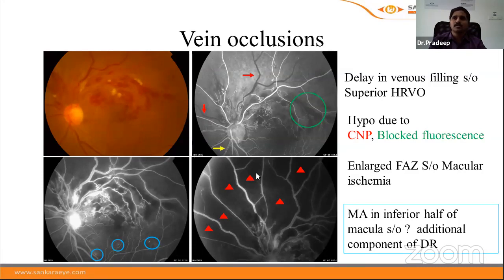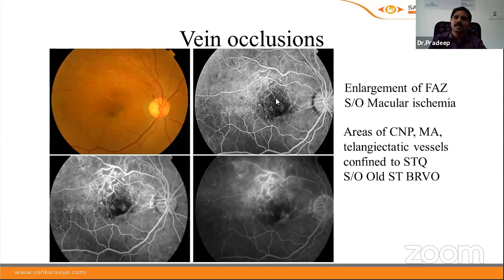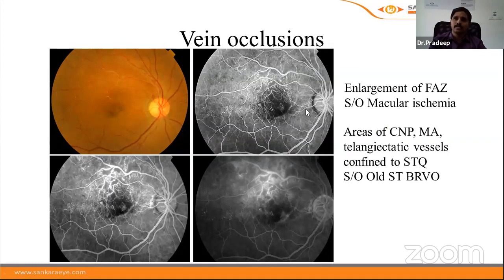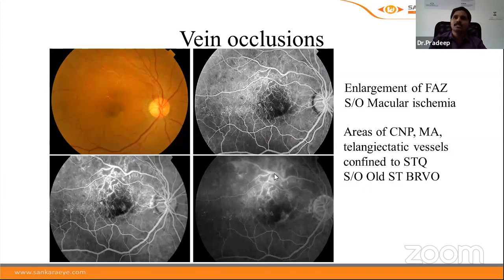In an old superotemporal branch retinal vein occlusion with macular ischemia, all features — including capillary non-perfusion, microaneurysms, and telangiectatic communicating vessels — are confined to the superotemporal quadrant. An old vein occlusion typically shows microaneurysms, telangiectatic communicating vessels, capillary non-perfusion areas, and may also show staining of vessel walls.